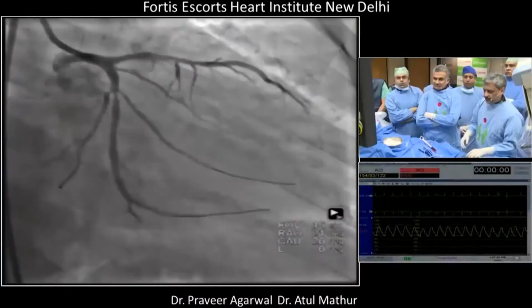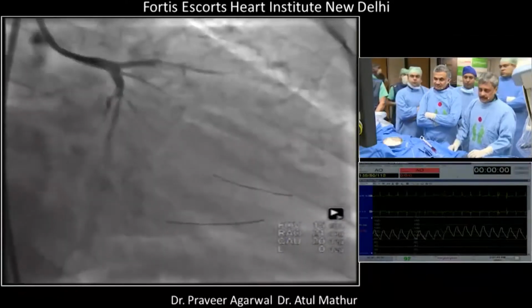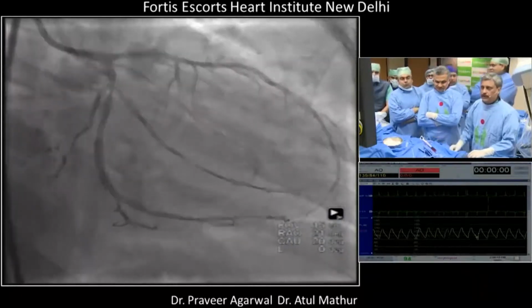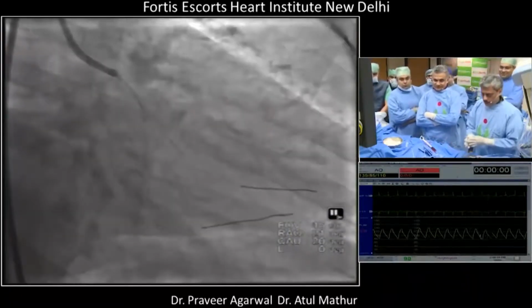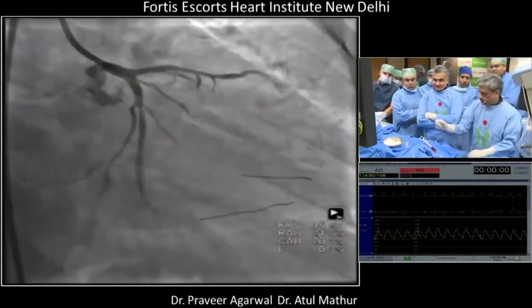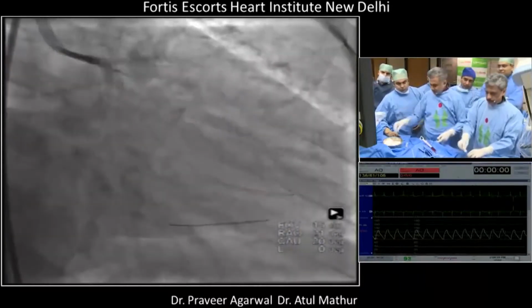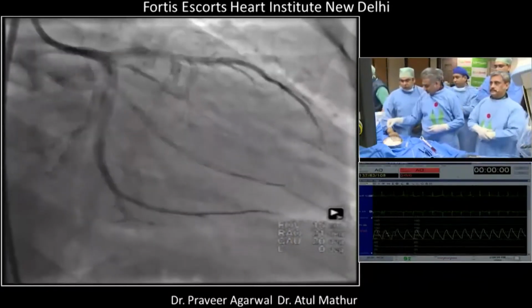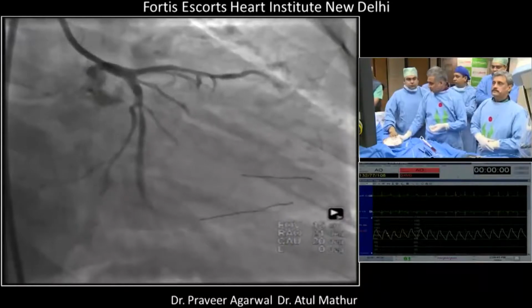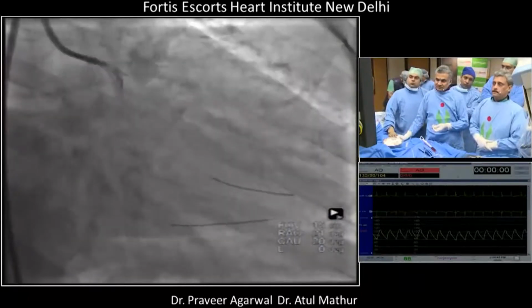And then Praveer was suggesting that we can also do our regular T stent or a TAP technique for this bifurcation. We can discuss the 3 strategies that I have described. And okay, who wants to go for, I don't know, the angle is good, but who wants to go for provisional crossover stent in the room? Provisional crossover stent, about 5, 6 people, 8 people. How about dedicated bifurcation stent, but the side branch is not good, not short enough. The lesion is longer here. Right. So nobody for dedicated bifurcation stent. One person.